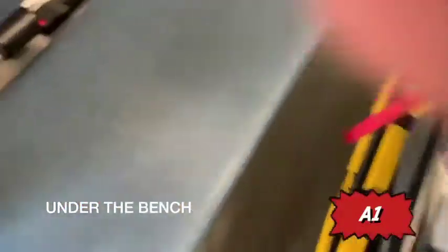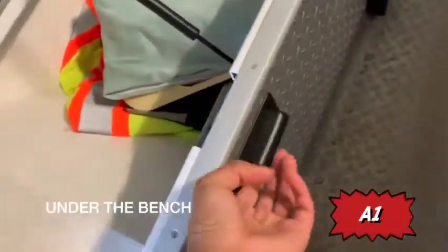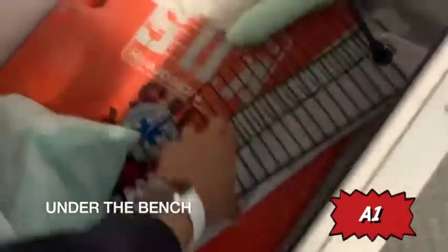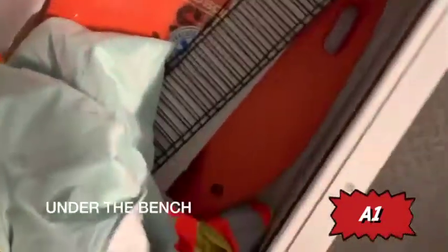Moving on to underneath the bench seat. Press the lever to open up the bench. Under here you have miscellaneous items: an illuminated vest, a bed pen, gloves, chalk, and ladder splints.